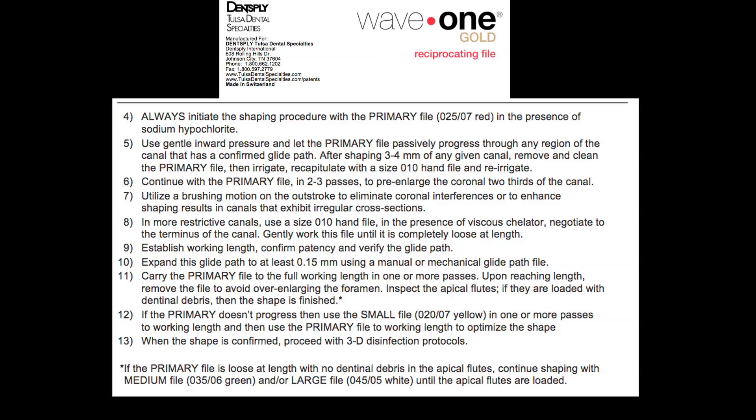We remove WaveOne Gold, observe the instrument, and clean the dentinal debris in the flutes of the instrument. We irrigate — you will see that the needle will go deeper and deeper. Then we take the instrument that established working length and ascertain that we have not blocked ourselves. It goes all the way to working length. Then we irrigate again and repeat the same process with WaveOne Gold until we reach working length.